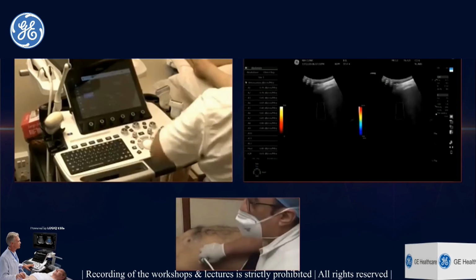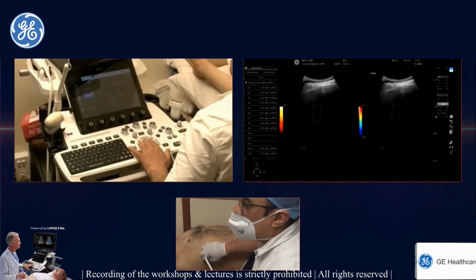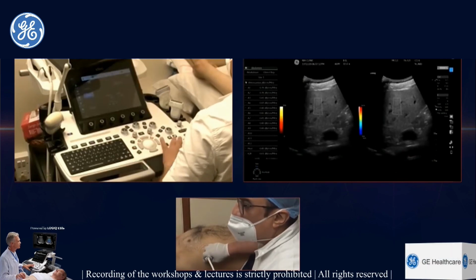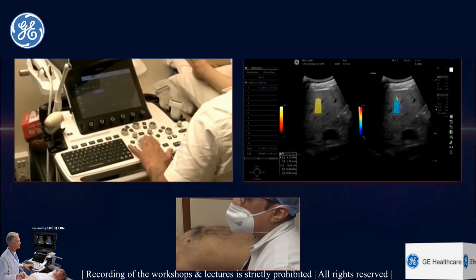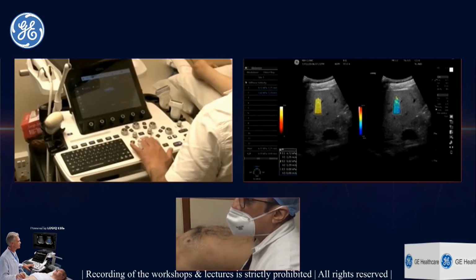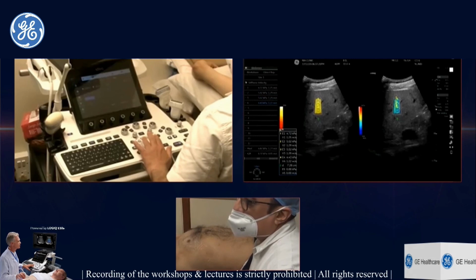Yeah, that's correct. And stop breathing. Oh, perfect. Okay, so we saw that by the correct technique, raising his hand and suspension of respiration, we could get good values, and there seem to be normal values.